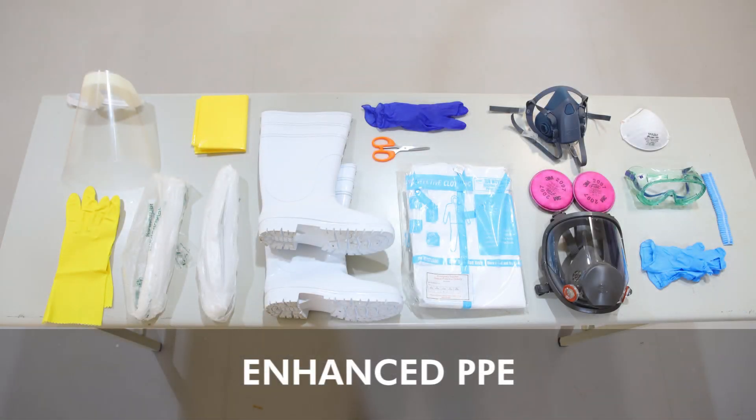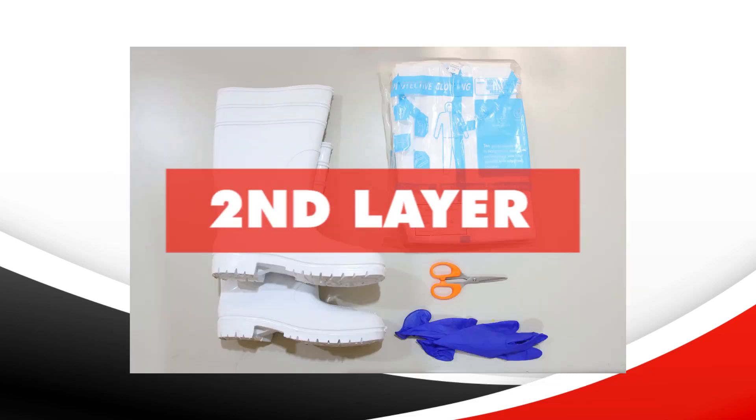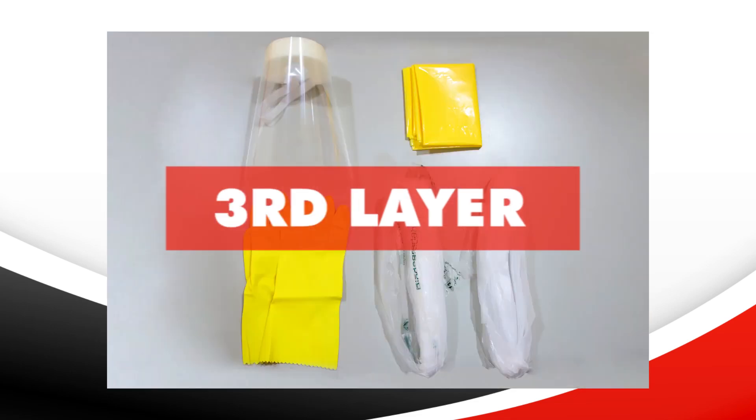The enhanced PPE is made up of three layers of items. Items are donned item by item, layer by layer.